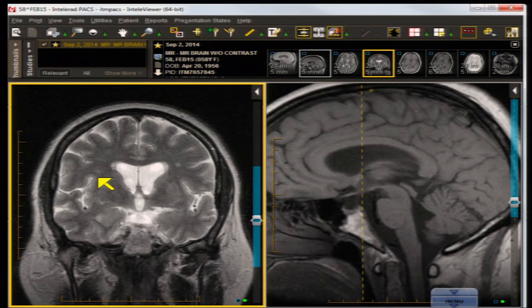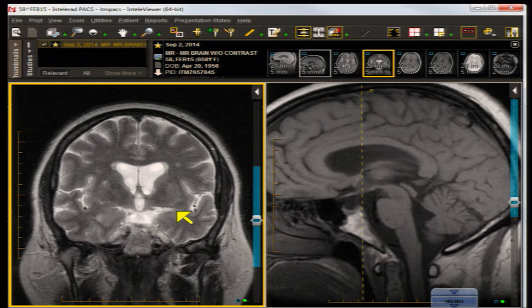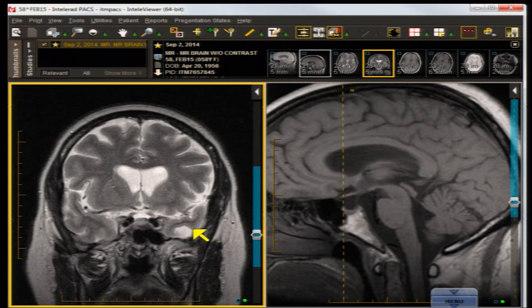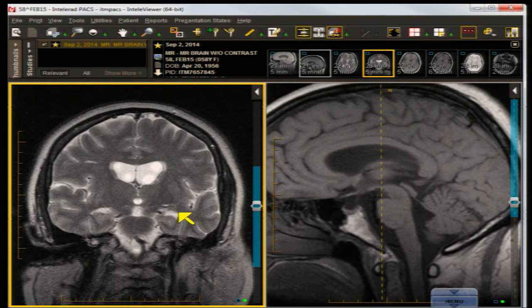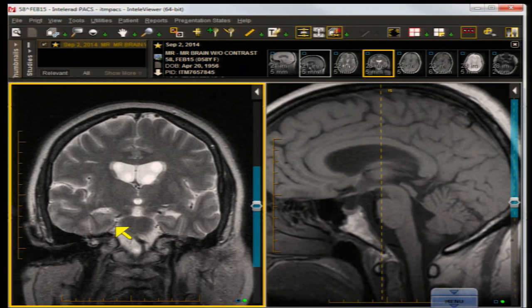In the latter stages, patients may develop other behavioral and cognitive disorders. On CT and MR, atrophy is seen in the perisylvian region of the frontal and temporal regions, and abnormalities are asymmetric — more severe on the left side, as seen here with prominence of the inferior temporal sulcus, prominence of the sylvian fissure, and the temporal horn more dilated on the left than the right. Perfusion on nuclear medicine studies is reduced on the left side in patients with semantic aphasia with dementia.